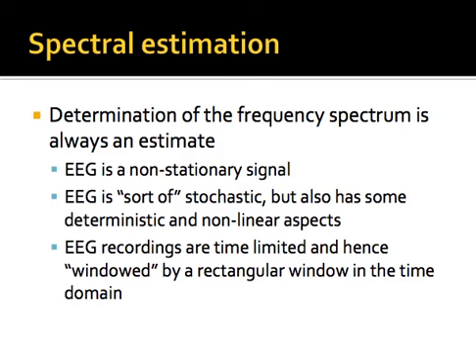A lot of times when you're processing EEG data and you go back and look at your data, you find that the values of the EEG at the beginning and end of the data set are very close to 0. That is usually because most computer programs like MATLAB, once you apply a filter, have also applied as a default this Hamming window. So once the data are filtered in the pre-processing stage, you often will look at your first few data values in your data set and see that they're equal to 0.